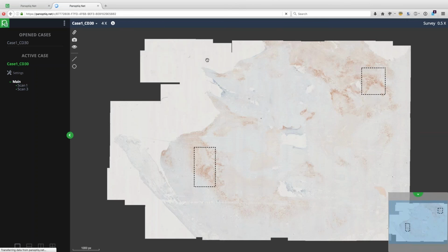And to the participants, this is a CD30 immunostain that I performed on this lesion. Again, the background fibrosis and mixed inflammatory infiltrate, you can see in the light blue background tissue color. And then, of course, there's a lot of brown. Richard, if you would just select one of those two marked areas and go to higher magnification, please.